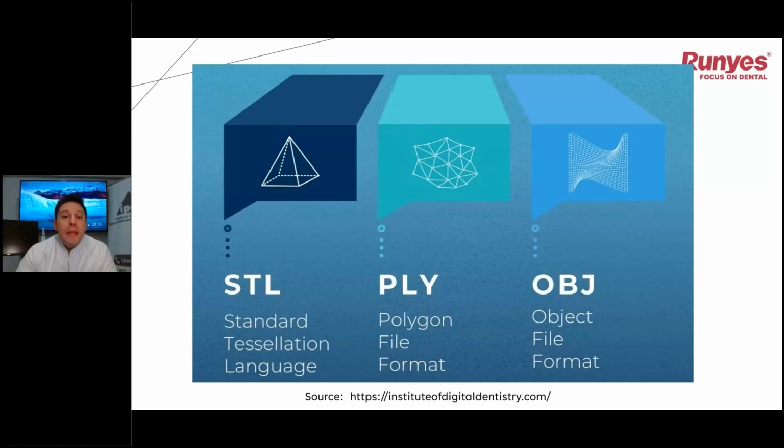Then we have the PLY, which is a file that can actually store color. Personally, I love to work with PLY files because it allows me to save in color, and it transmits the idea better to our patients.